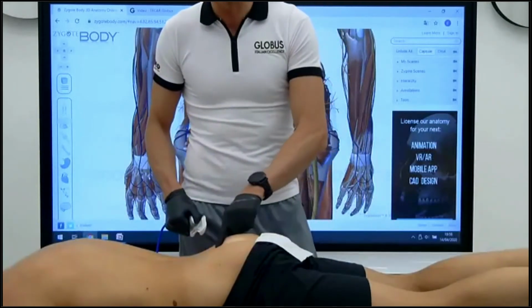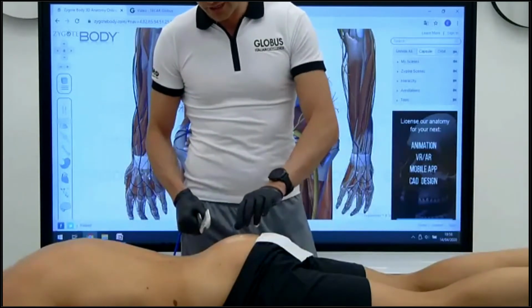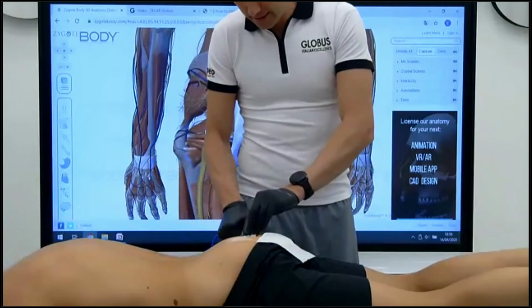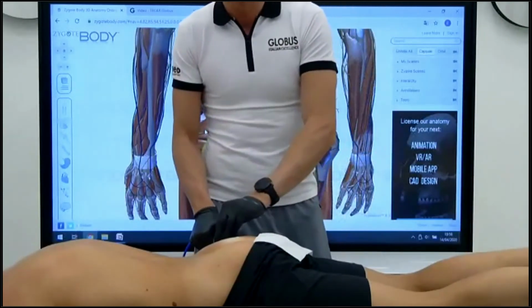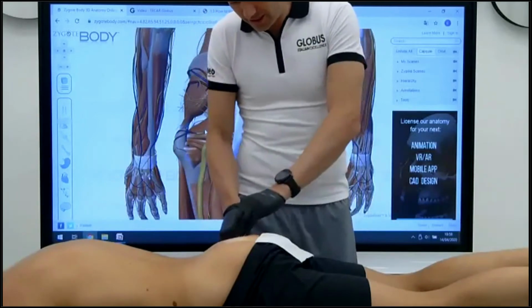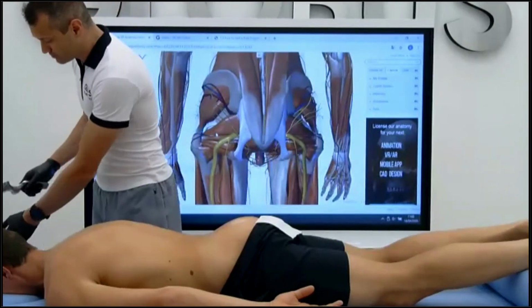Also, you can see here that maybe you cannot, but we are starting to promote vascularization of the tissue, of course. With this technique, we don't need to have ecchymosis, like you said of the ancient technique. We don't need to do a lot of mechanical movement. I will explain something.